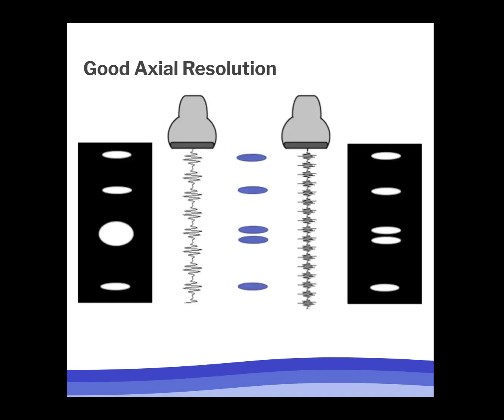Most of the reflectors in the body are just going to be mere millimeters, if not even less, apart, and our ultimate goal in ultrasound is to create the most accurate image of the body as possible. Knowing this, we can confidently say that a low numerical number means that the image displayed is more accurate than a high numerical number when calculating axial resolution. So let's take a look at an example.